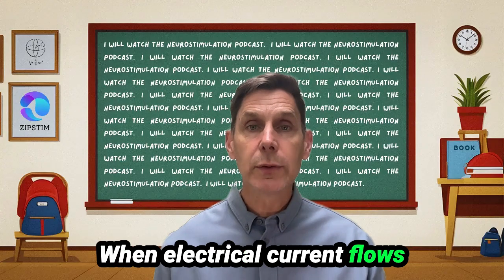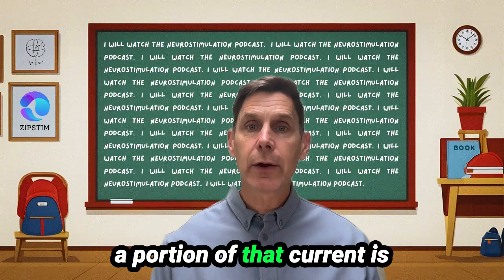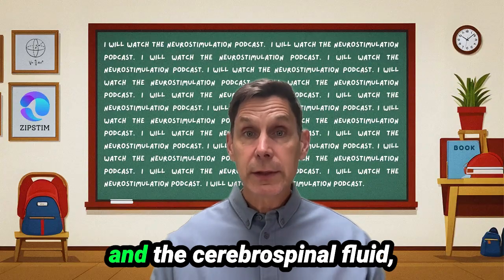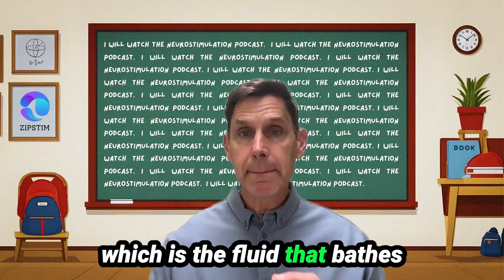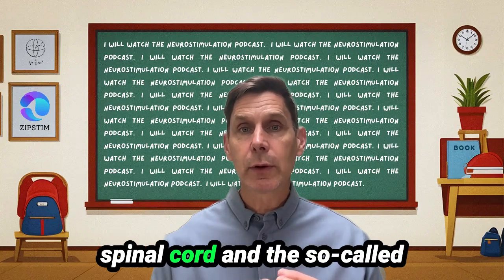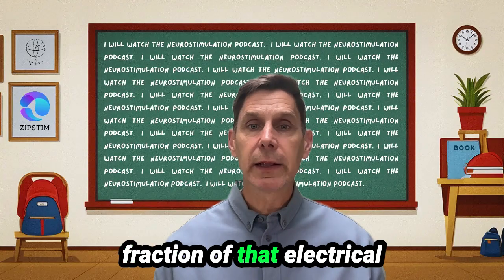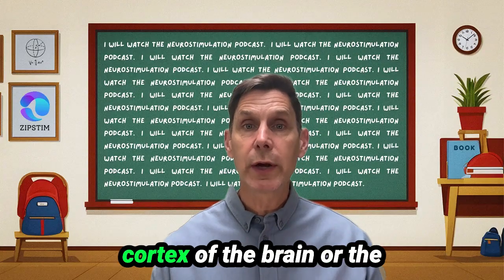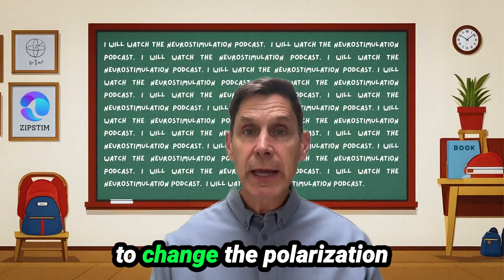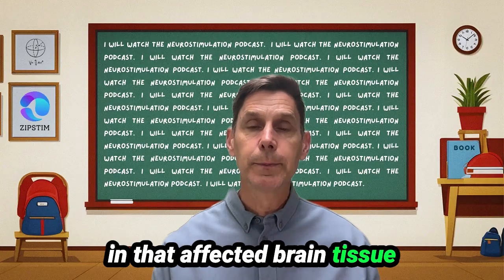When electrical current flows from the anode electrode to the cathode electrode, a portion of that current is absorbed or redirected by the skin, scalp, the skull, and the cerebrospinal fluid, which is the fluid that bathes the outside of the brain and which is found inside the spinal cord and the so-called ventricles of the brain. However, a measurable fraction of that electrical current actually reaches the cortex of the brain, enough to change the polarization tendencies of the neurons in that affected brain tissue.